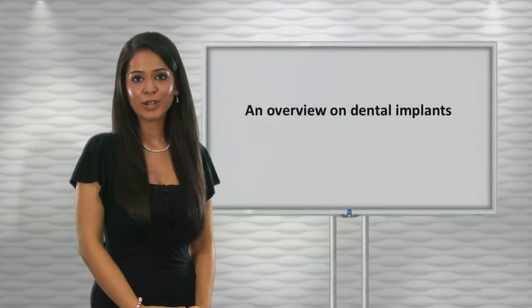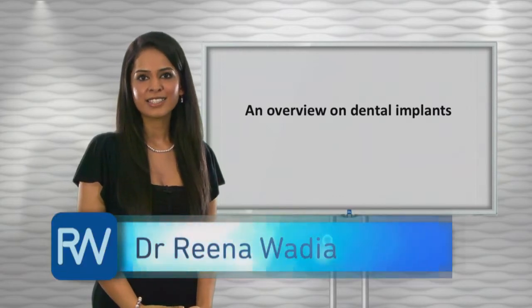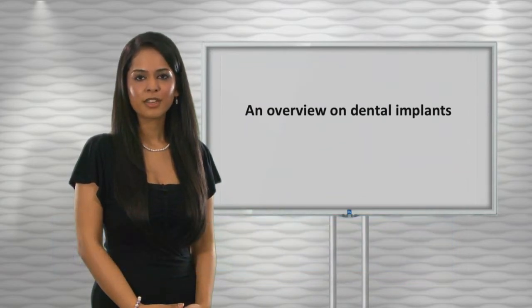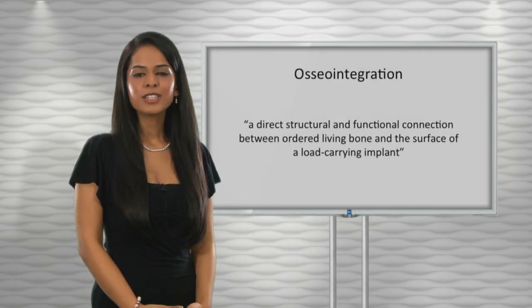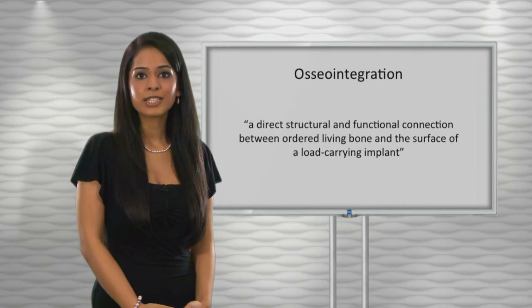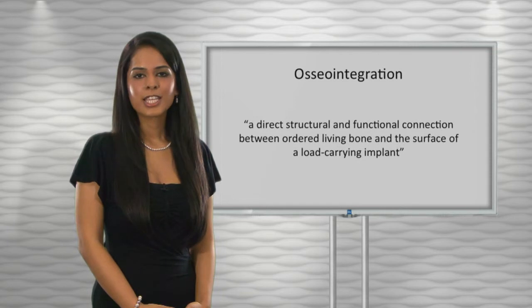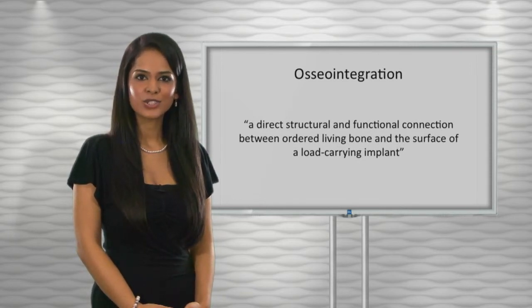Over the last decade, implantology has become an indispensable part of mainstream dentistry, helping dentists to improve the quality of life of large patient populations. The phenomenon of osseointegration of implants was discovered in 1952 by a Swedish orthopedic surgeon, Professor Brånemark. He defined osseointegration as a direct structural and functional connection between ordered living bone and the surface of a load-carrying implant. It's believed that Brånemark's work constituted the birth of the era of evidence-based dentistry.